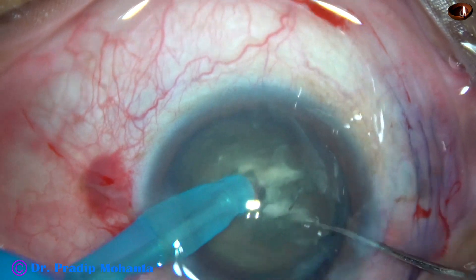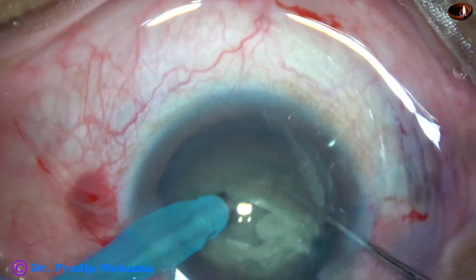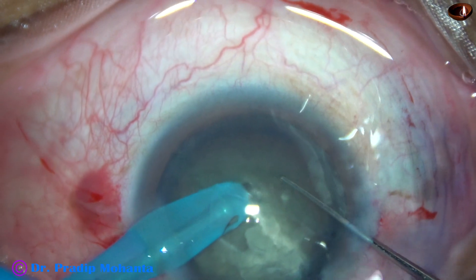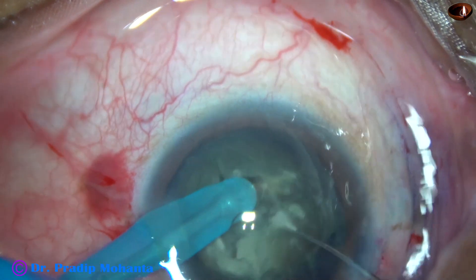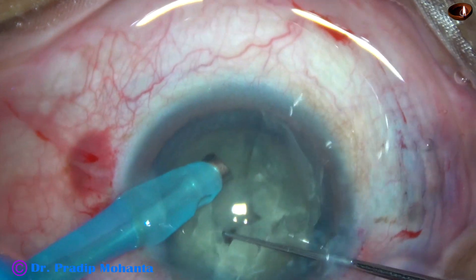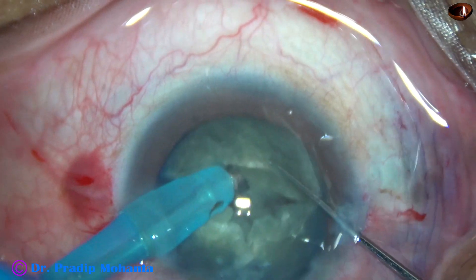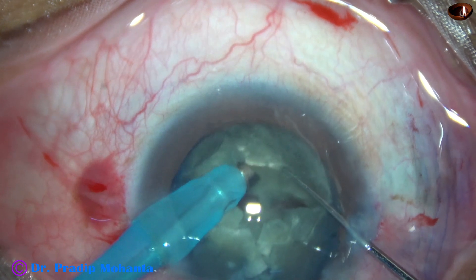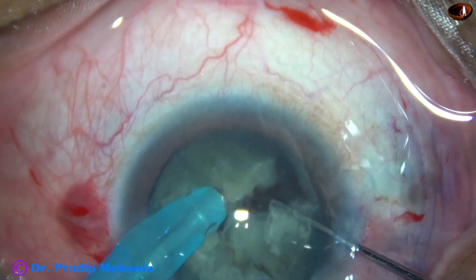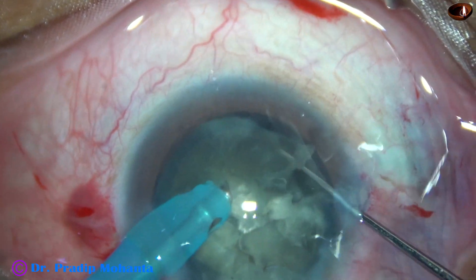The chopper is in my right hand, and this is a nice crack. Rotate the nucleus, bury the tip at another place, and get another piece. Rotate the nucleus almost 180 degrees and get one more. This semi-nucleus is divided into two pieces, then one more piece.